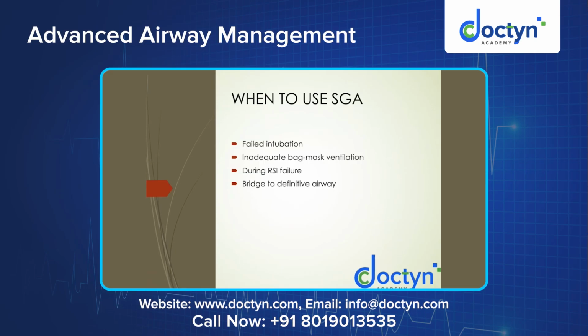So let's go with the sequence. The patient is unconscious and you have decided to secure his airway because he is not able to, there is increased risk of aspiration and he is not breathing well. Right now we give a jaw thrust and we'll ventilate with an Ambu with 100% oxygen. So the oxygenation is maintained now.